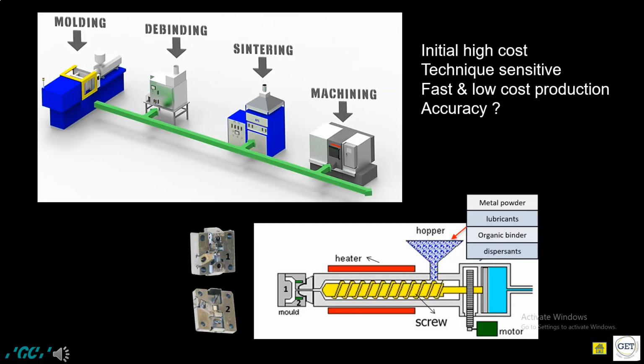In the following figures, the MIM process is demonstrated to clarify the manufacturing technique. Initially, a powder containing metal and some other materials is inserted into heating chambers and heated to the fluid status. Then under high pressure, the metal is injected into cavities to gain the bracket shape. The next two steps, the debinding and the sintering, are meant to extract the unrequired materials and to maximize the condensation of the raw bracket.